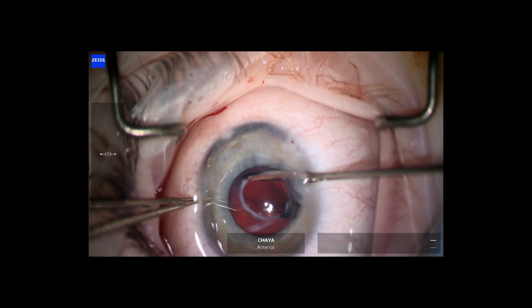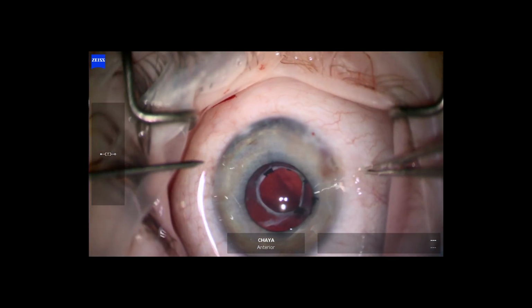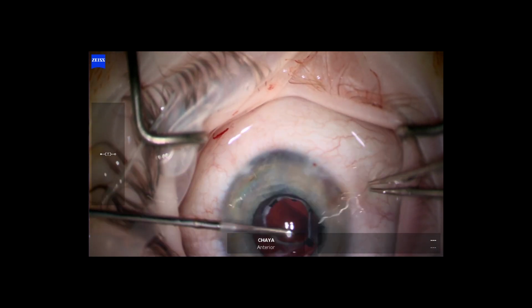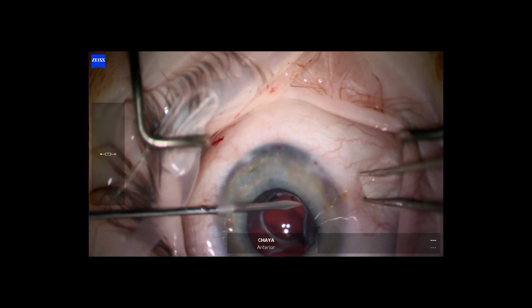This is another similar case. As you can see in both cases, there's an area of fibrosis in the center where the anterior and posterior capsulotomies have been done. The capsules have fused together here, and this can create a very thick but stable structure.